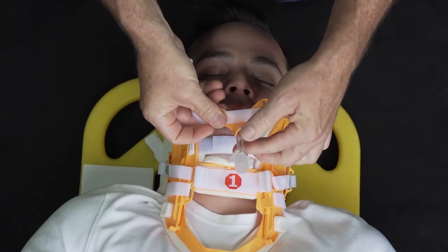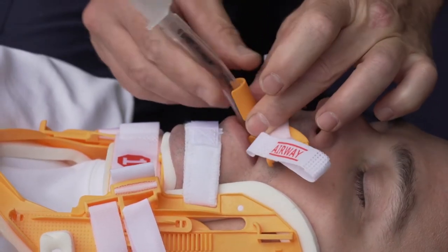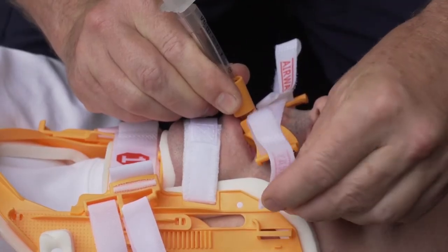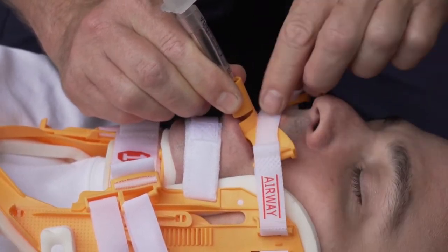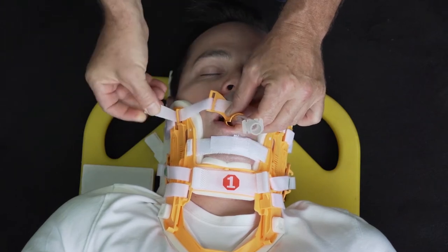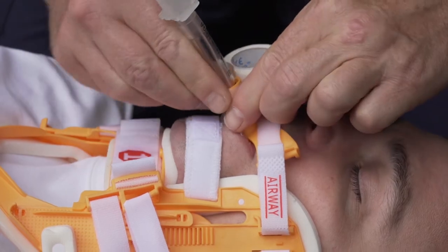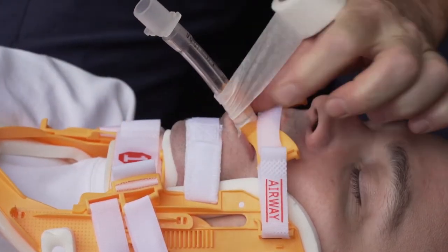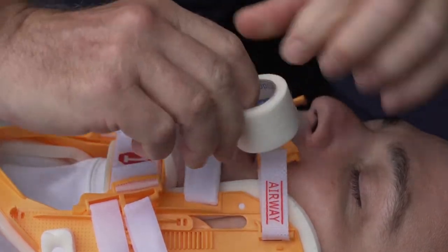Place the new X-Color tube holder on the tube and slide the bite lock into the patient's mouth. Secure the tube holder's short strap marked 'airway' on both anchor points nearest to the patient's mouth. Secure the tube to the tube holder by pinching it around the tube and placing two wraps of adhesive tape — one around the tube holder and the second around the tube itself.